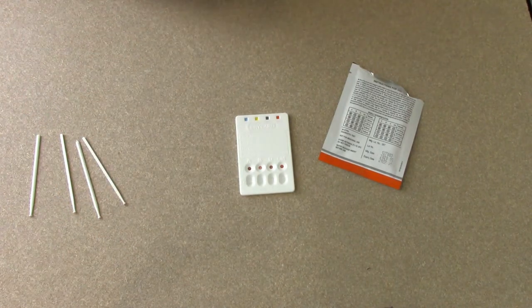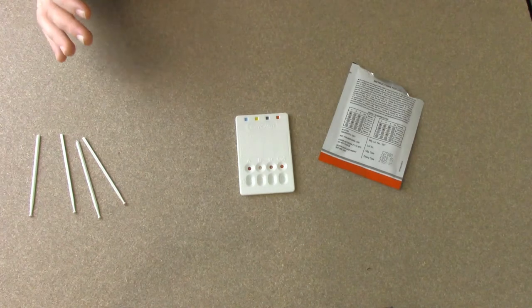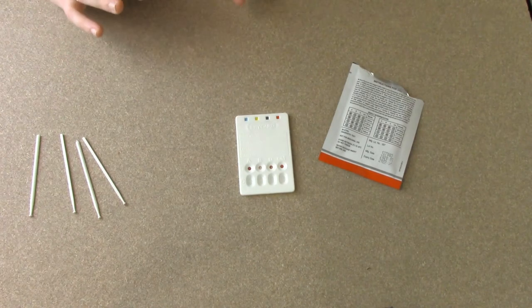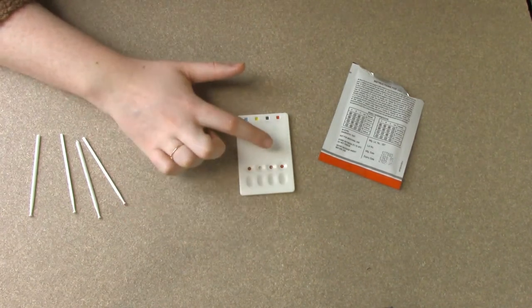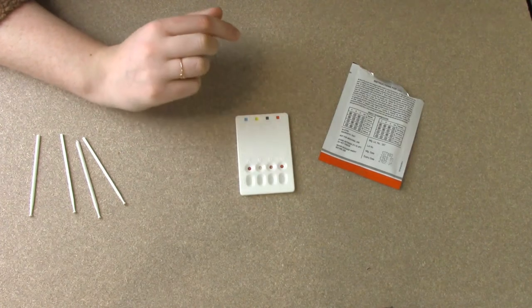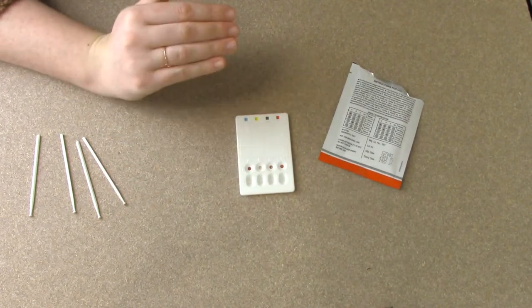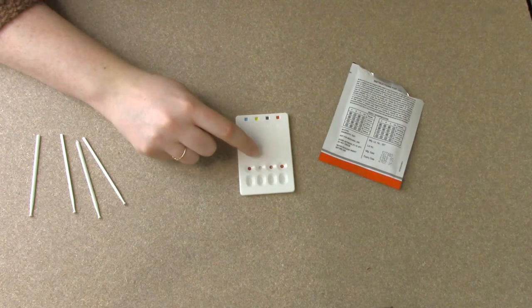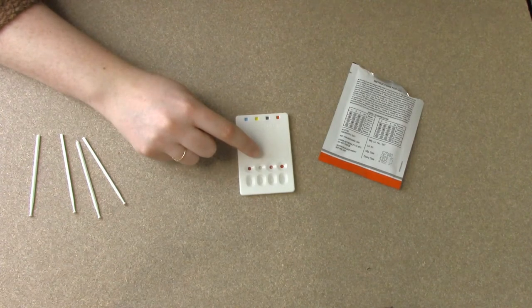All right, now we just get to watch and see what happens over the next three minutes. Basically, what is going to happen is this will start to change. The test will change in certain wells will stay red or they will completely become clear. You can see that B is losing all of its color.